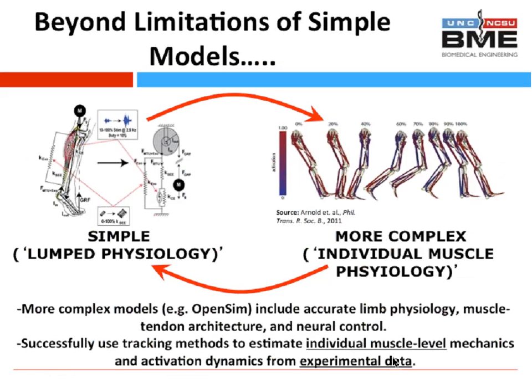We don't know what's happening with individual muscles. Our model of energetic cost is for the lump triceps surae, so we don't know whether or not we're affecting, say, soleus more than gastrocnemius, and other things like this that we feel like a more complex model could much better address. And so that's where Dominic's project with OpenSim sort of took off.